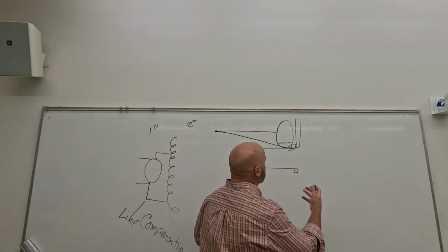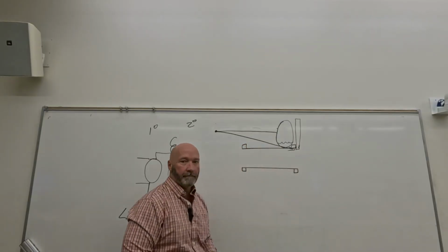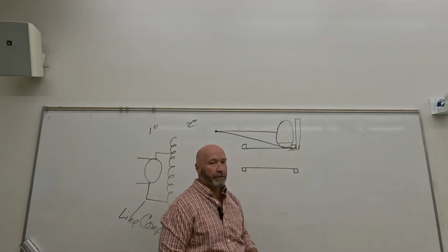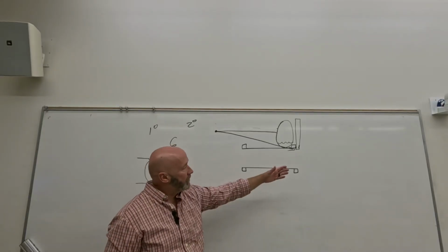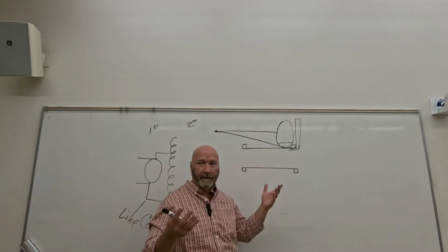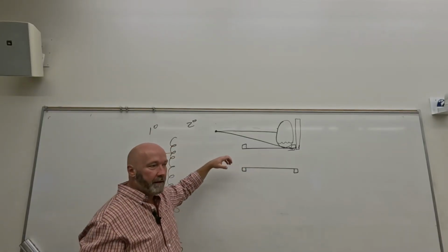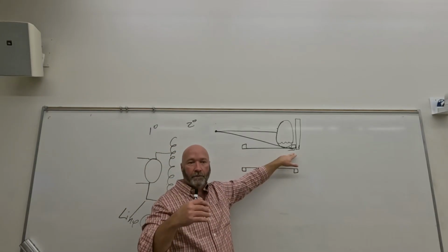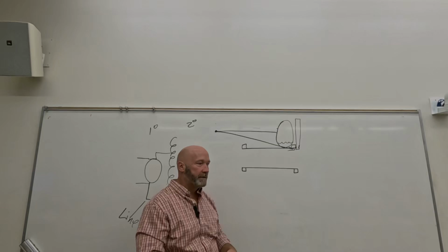If you drop this down so that you can get the entire lung below it, you still have a problem, right? You're going to have this massive artifact that's going to cover your pleural effusion. You might not be able to see it. So that's going to be a problem. You're going to have to go in front of that, and you're probably going to have to build the patient up, or if you do go behind it, you're still going to have to build the patient up, right? So that's a drawback to the curved tabletop: the support systems on top of the tabletop could give you an artifact on the image on things like cross-table laterals and decubitus and things like that.